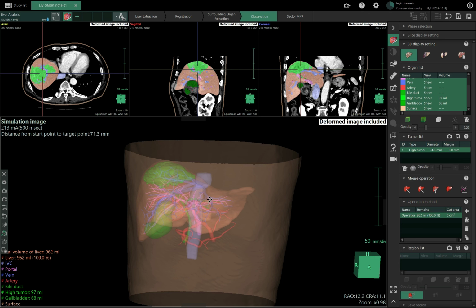In this hospital, Puerta de Hierro, what I said to them is, I won't see what Cela has, don't show me the result of Cela. Just give me the same study you give to them, and I will just do what my software does automatically. Then you compare the results of the Sinus 3D software against the Cela extraction, which will be verified and modified by a radiologist, while mine goes by default. So they still have to compare.